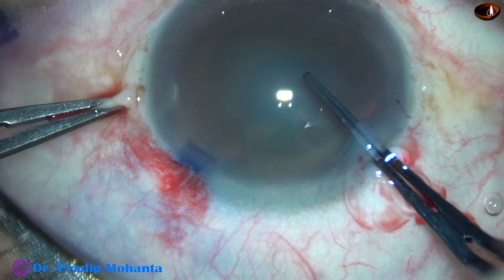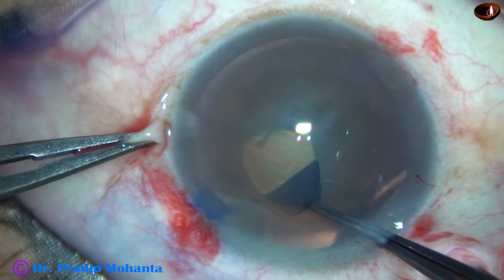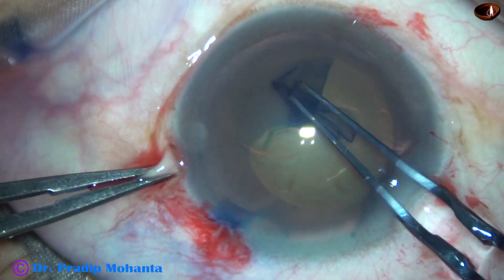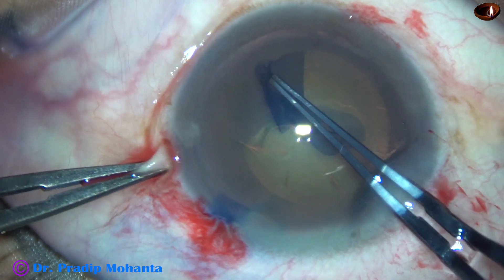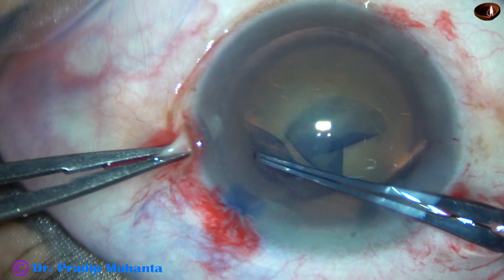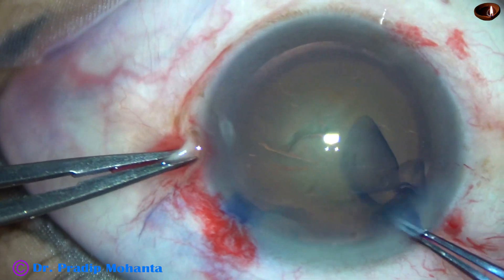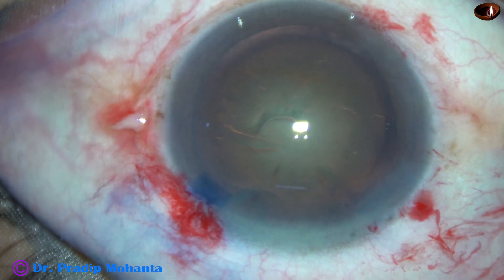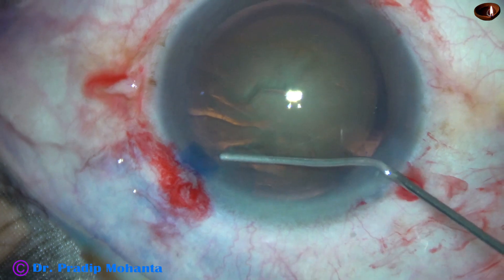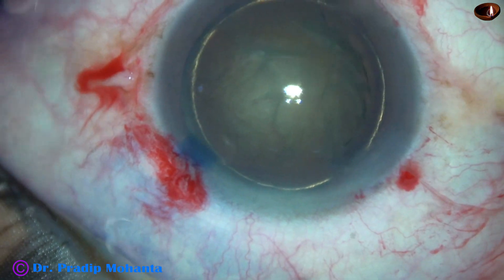Now, keeping the anterior lip lifted up, all other maneuvers are done. The anterior capsule is torn, a capsular tag is raised, and the tag is guided anti-clockwise — or you can guide it clockwise according to your comfort. At 3 o'clock the rhexis runs to the periphery, and then I pull it like this and bring it back. The pull is not exactly central — a little bit tangential, a combination of centripetal and tangential force, is good for bringing the rhexis back on track.